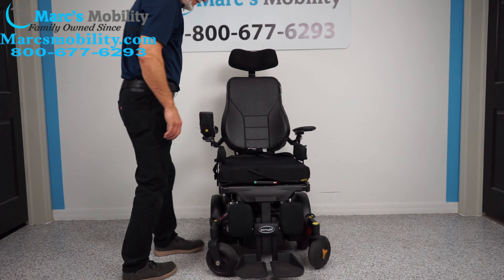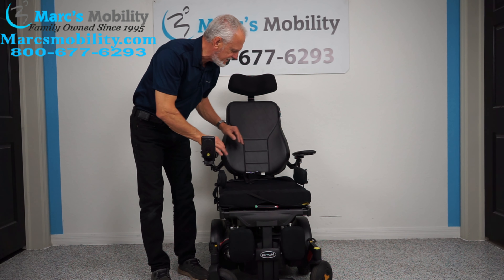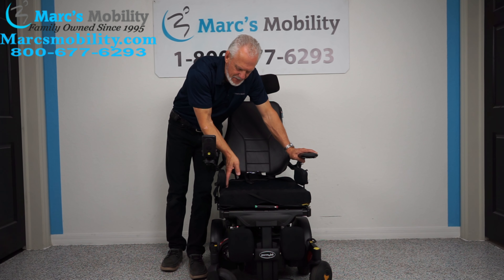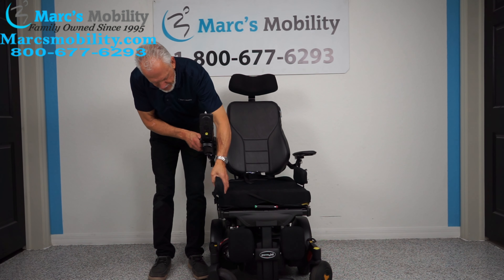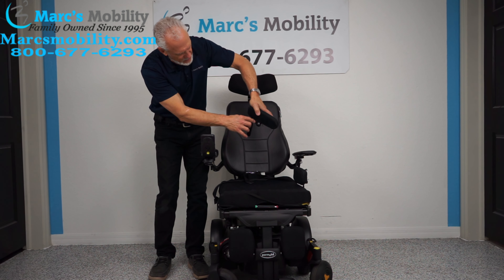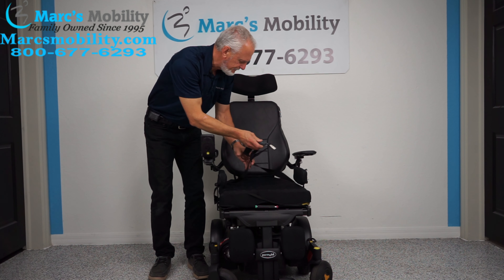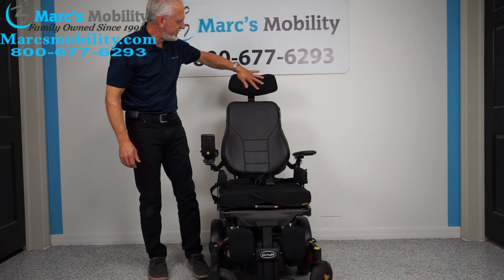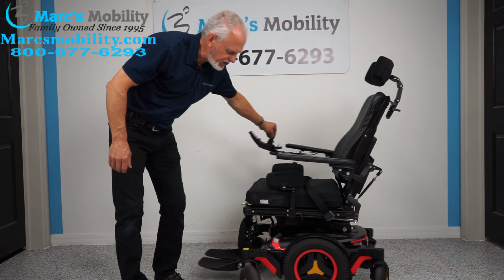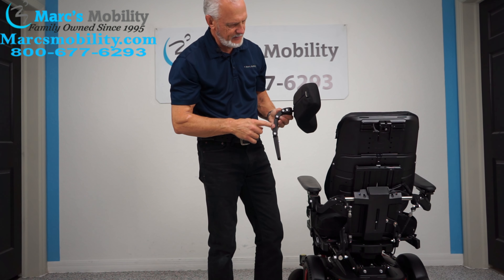The seat on this chair is 18 by 18. We can adjust the seating system — if it's too big or too small we can change it. There are lateral pads that keep your knees or hips from going off the footplate. They're adjustable along the track, in and out, with multiple adjustment points. The chair also has a safety belt, flip-up arms, a nice leather back, and a big headrest that is fully adjustable.